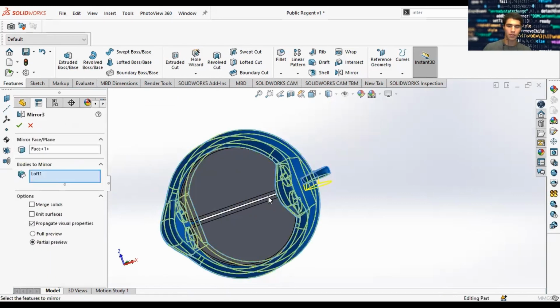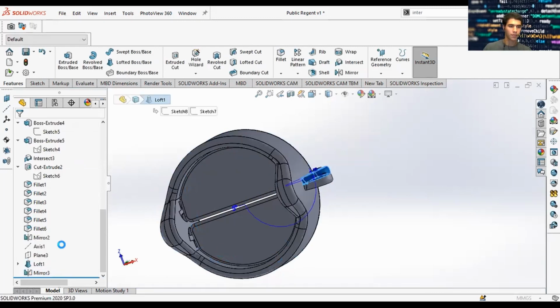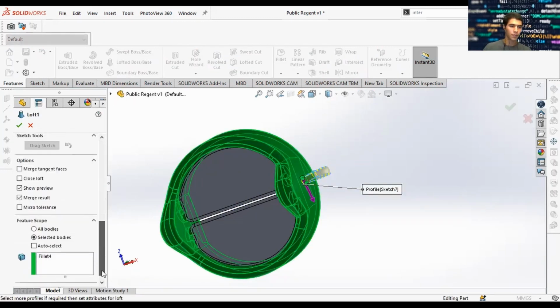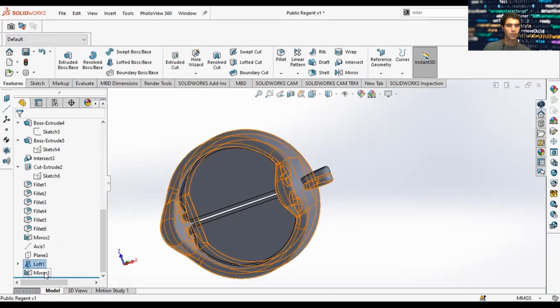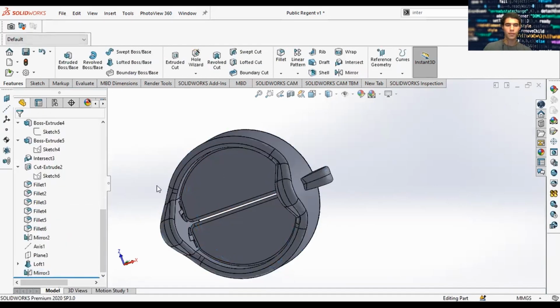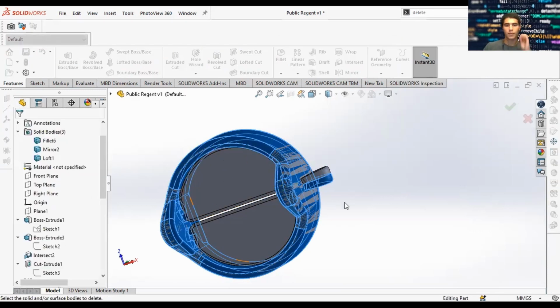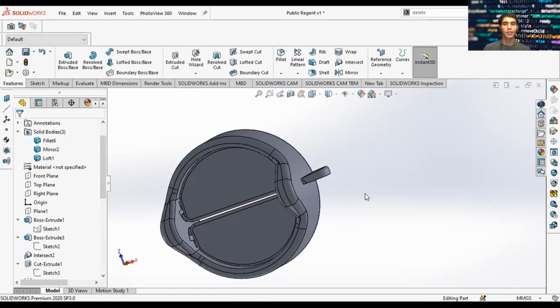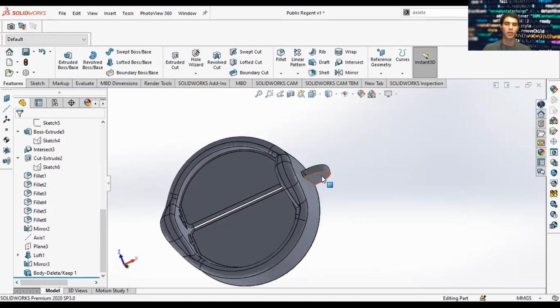Let me go ahead and edit this here. There we go. All right. So we had an extra body that came with our loft feature. So one way you can delete or keep bodies is by just pressing body delete/keep. So back to our loft.